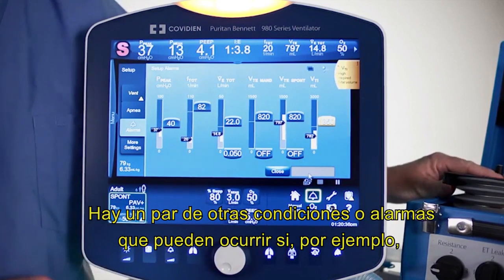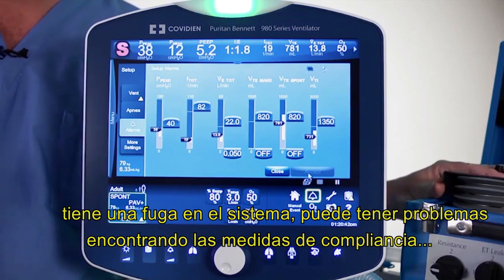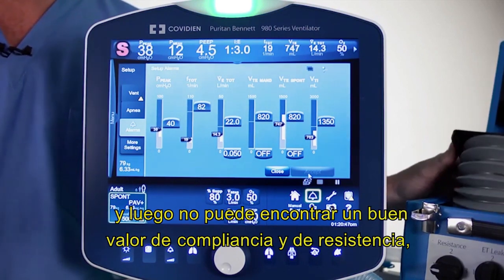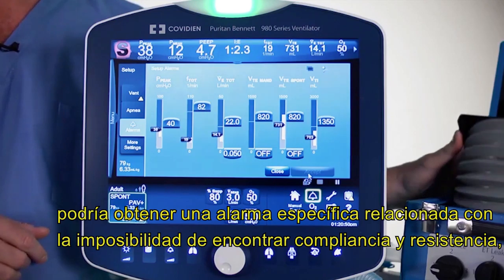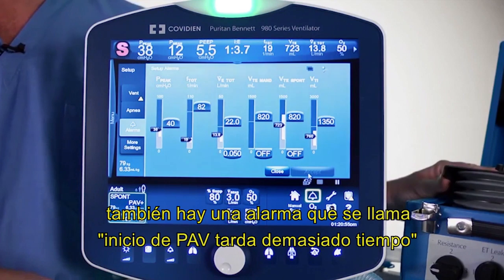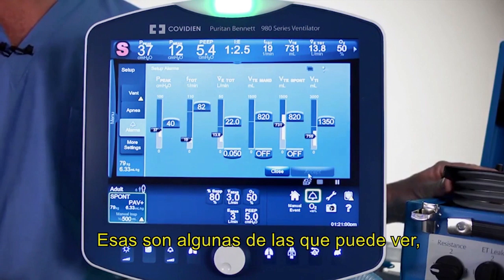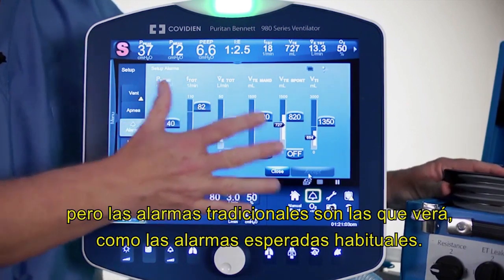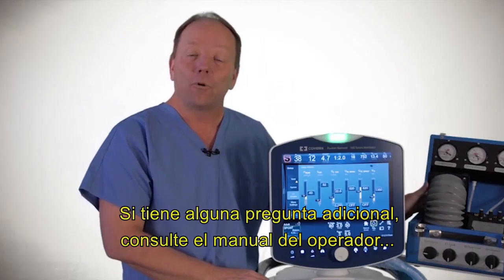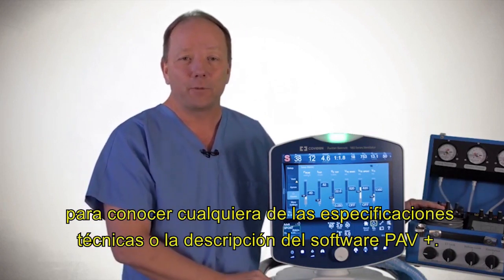There are a couple of other conditions or alarms that could occur. If, for example, you had a leak in the system, it may have trouble finding those compliance and resistance measurements that it does every 4 to 10 breaths, and then it can't really find a good compliance and resistance value. So you might get a specific alarm related to not being able to find compliance and resistance. There is also an alarm that's called PAV Startup Too Long, and it may be associated with this same kind of condition. So those are some you may see. But the traditional alarms are the usual expected alarms that you will see. So for any additional questions, please refer to the operator's manual for any of the technical specs or the description around PAV Plus software.